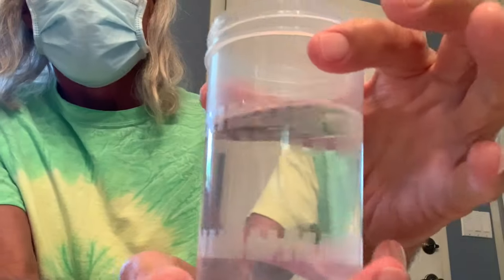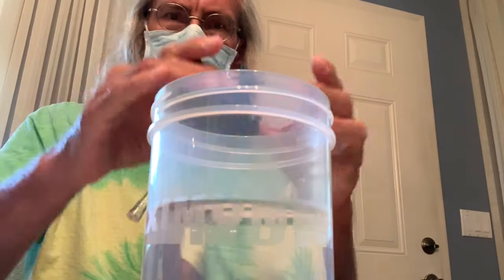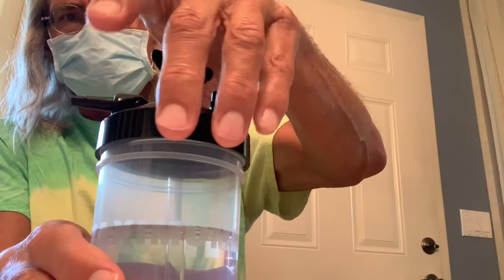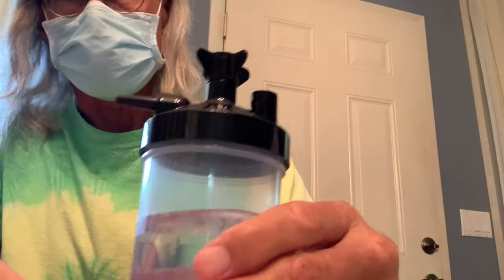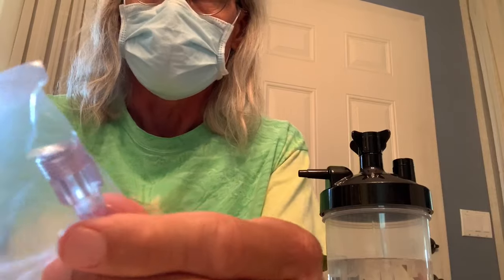Set it down and it should settle right at the very top of the maximum line — that's where we want it. Then we're going to set the top right inside there, slide it on, and screw it down. You want to make sure you've got a good seal so it doesn't leak. This connector piece has threads that go right into the very top — you stick it in and screw it on.